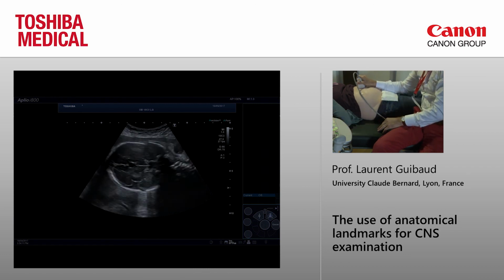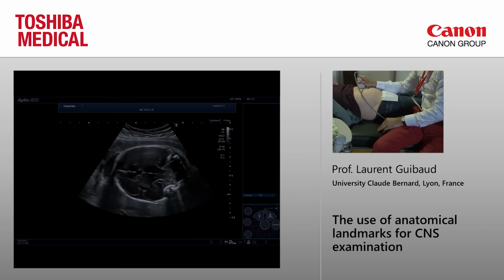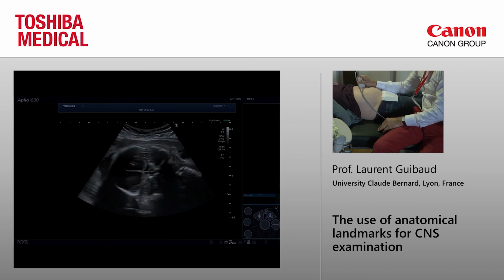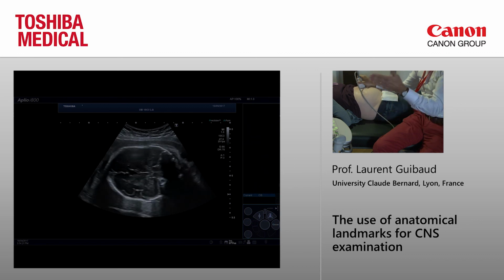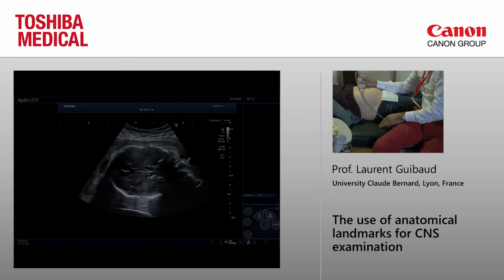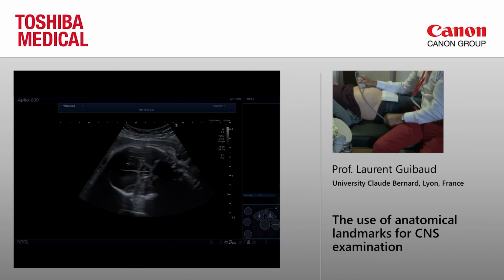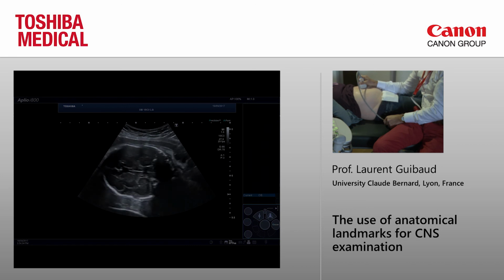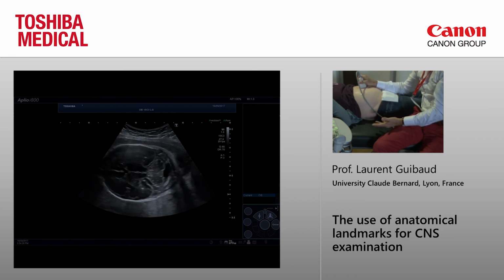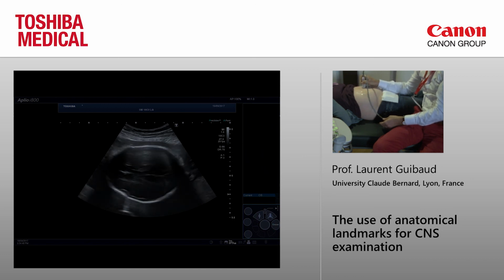So we can go from here to here, and it can be interesting to do that. If you cannot do a sagittal view, you can do a coronal view, just to be sure that your corpus callosum is well identified. But in that case, you cannot measure the length of the corpus callosum. But in routine, it's not useful to measure the length.